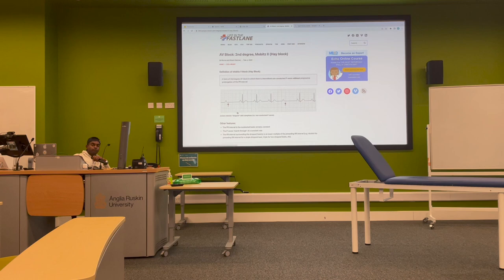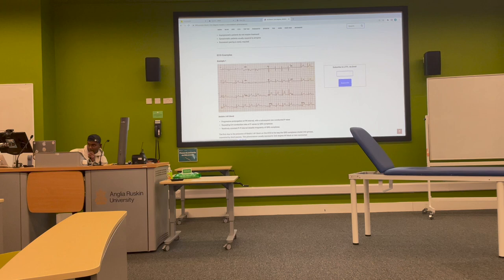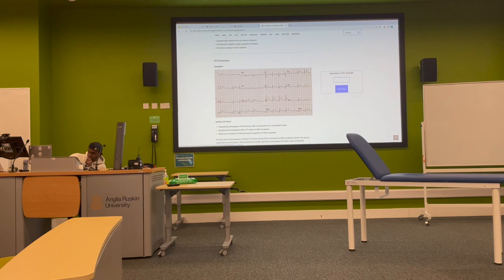And it helps regain a rhythm. And pacemaking is required very, very rarely, permanently. So, tell me about the leads. One, two, three. This is the rhythm strip. So you can see in the rhythm strip, just use the rhythm strip usually.